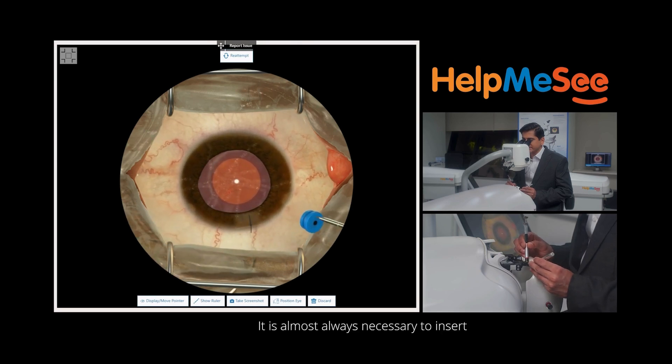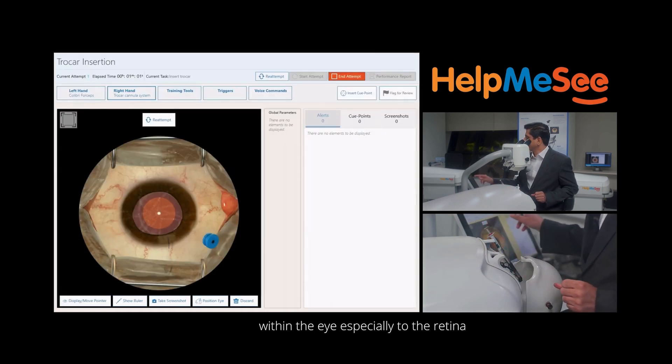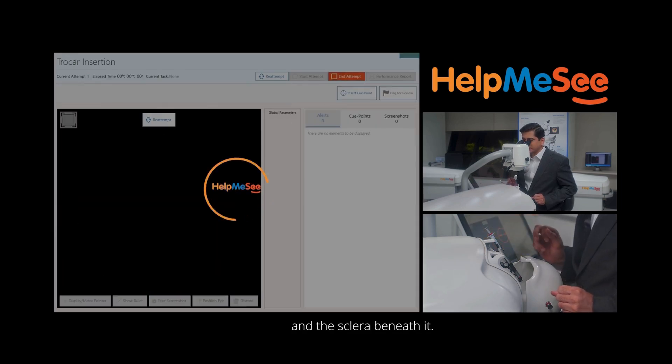It is almost always necessary to insert the trocar rightly through the correct angle, otherwise if it is not at the correct angle it will cause damage to the structures within the eye, especially to the retina and the sclera beneath it.